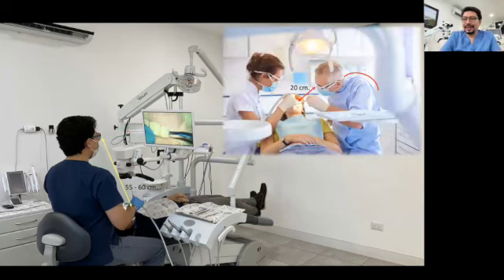We don't need to work in this way. Look at this doctor, 20 centimeters away from the mouth of the patient. And during the pandemic, we understood how important it is to have a proper distance, a safe distance, a biologically safe distance between the mouth of the patient and our head.